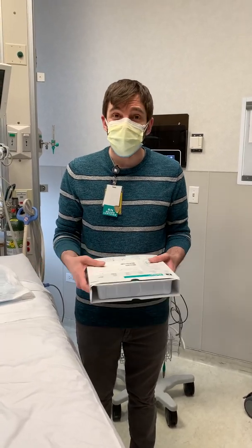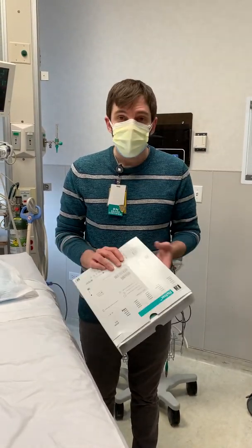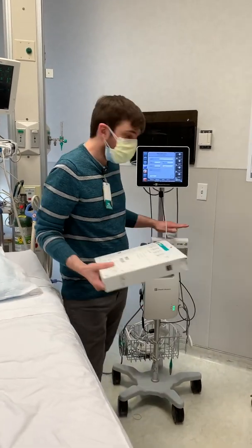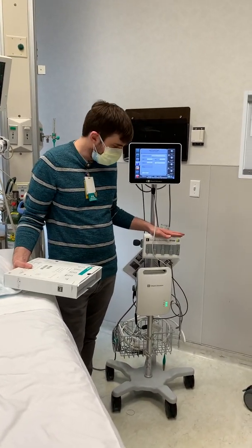This is how we set up the FlowTrack for the EV1000. You have to have an art line for the FlowTrack part. The FlowTrack is the top piece here for the EV1000.